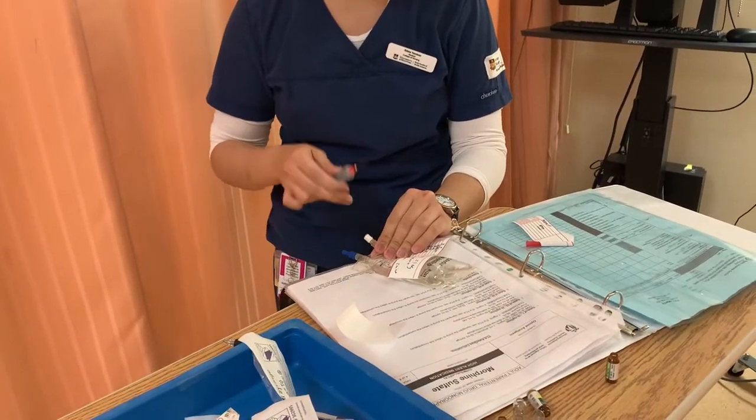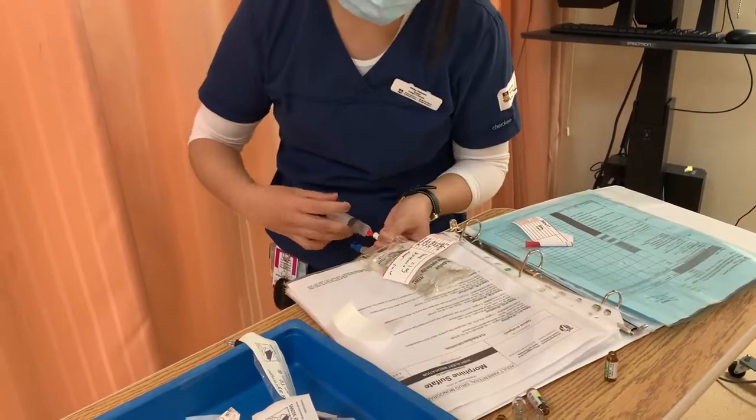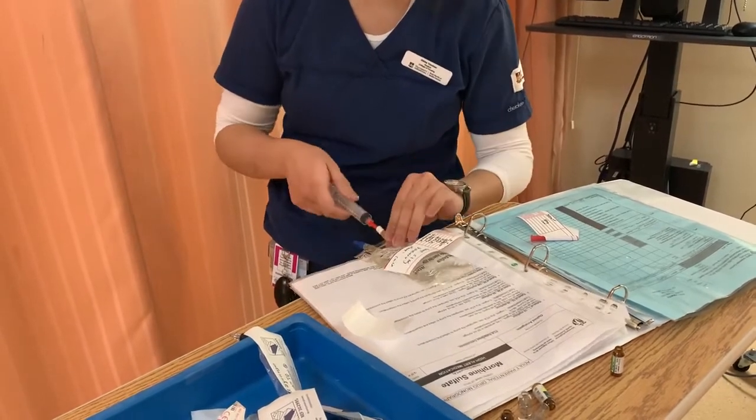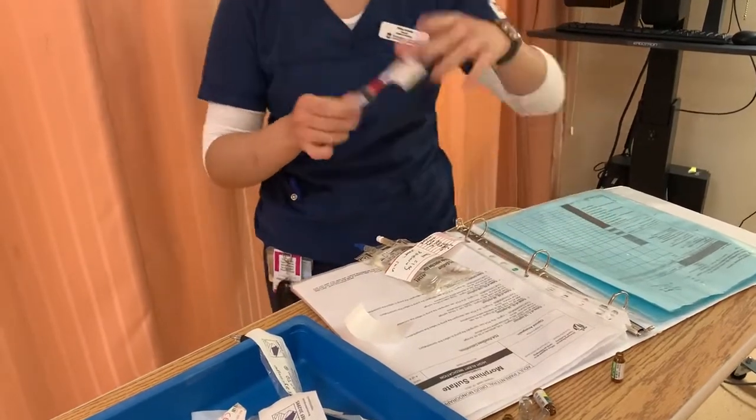It's not touched with anything. I cleaned it for 30 seconds, I dry for 15, and now I can inject it and make sure that this is the morphine. There we go. And I shouldn't be waving my needle like that as well. There we go. So this goes to the sharps container.